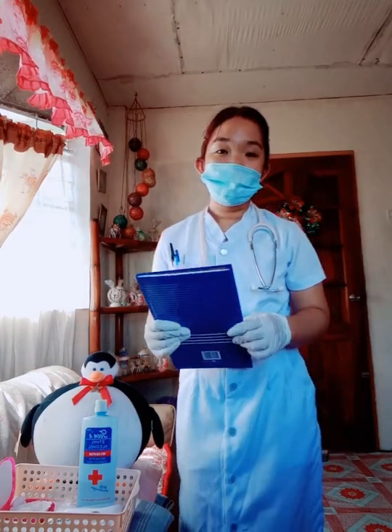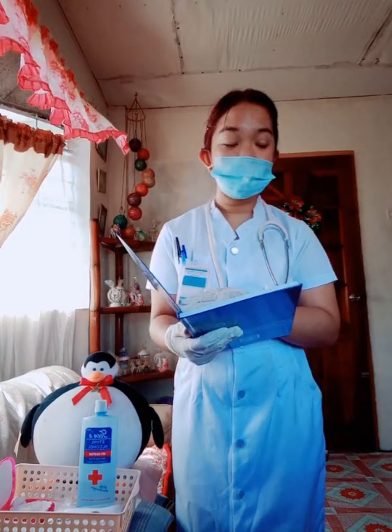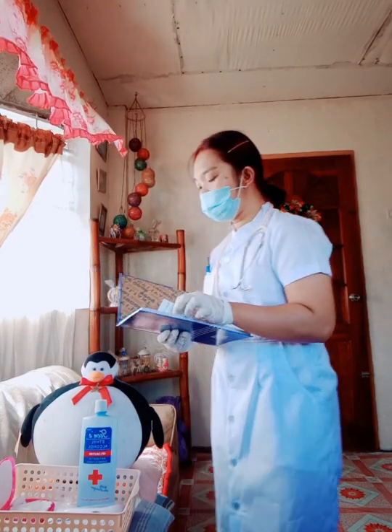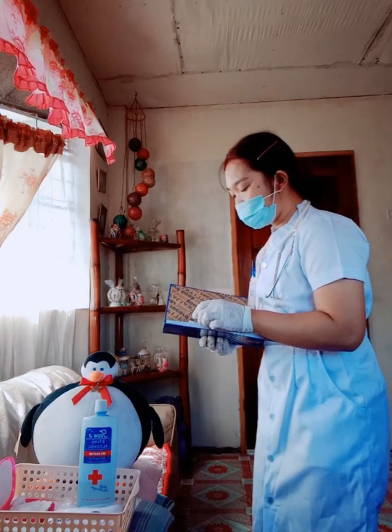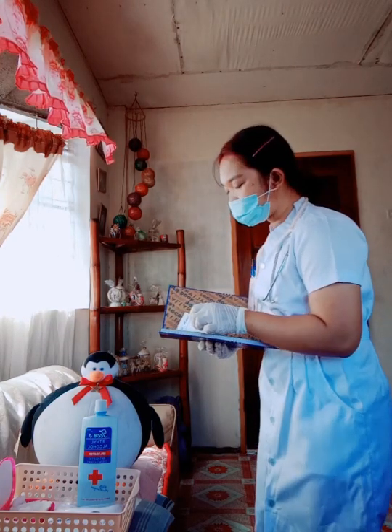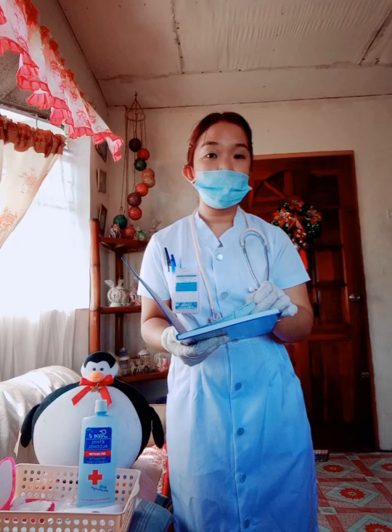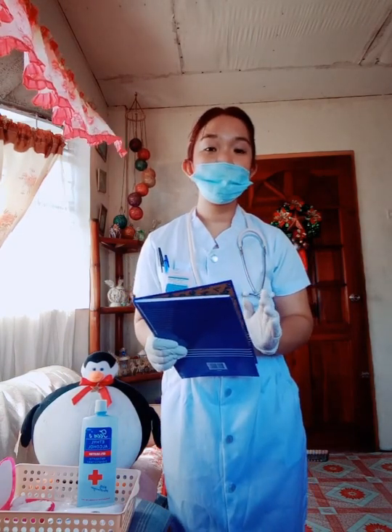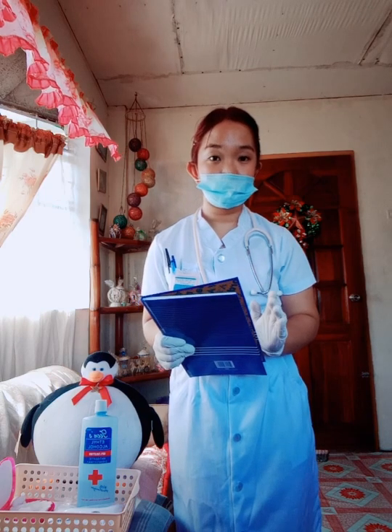The fourth step is to check for client's information and identification. So, ma'am, are you okay? Your age is... And once we've confirmed the identification information of the patient, we can now position the client in their most comfortable position.